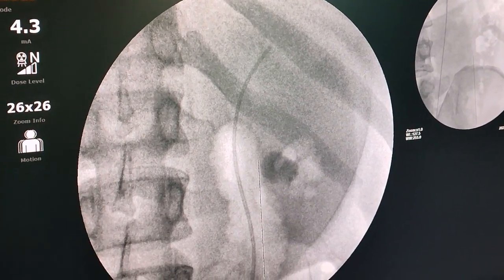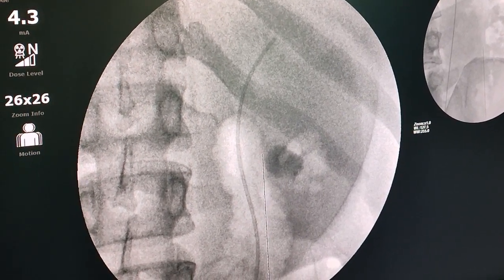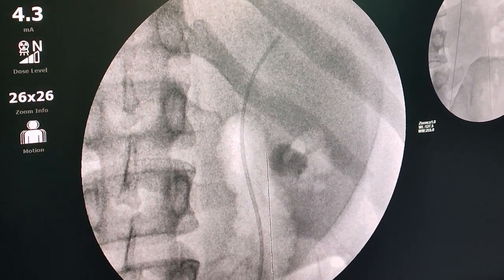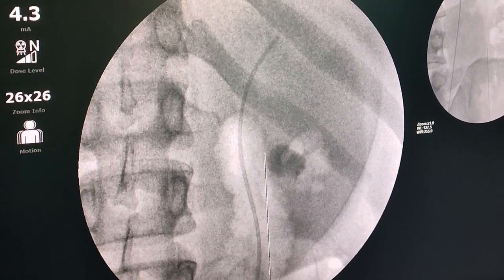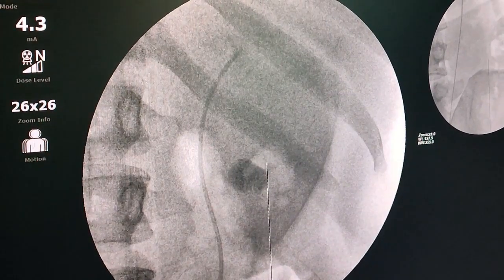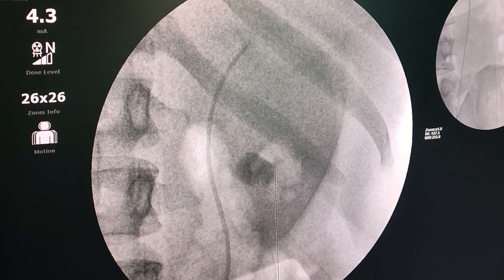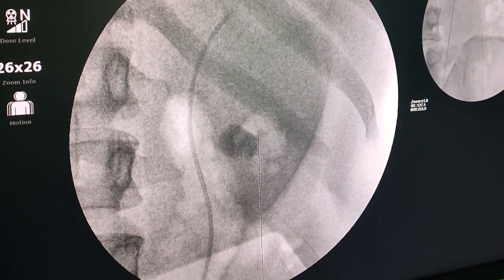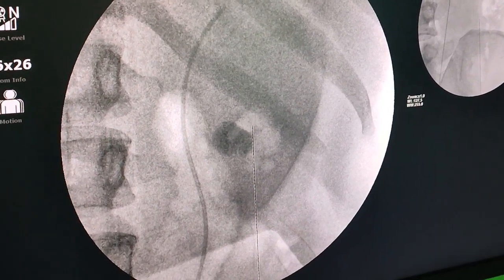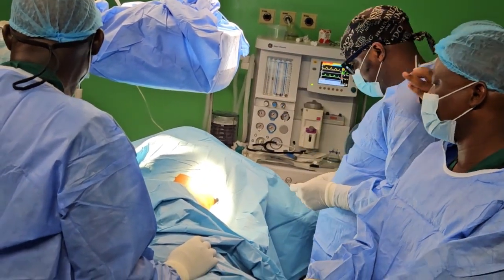So, listen. Can you move slightly towards me? Just slightly. Perfect. Excellent. So the idea is your needle coming from the side. You need the clearance so that everything is fine. The build at this stage is very critical. So please, I need the pedal to my side.